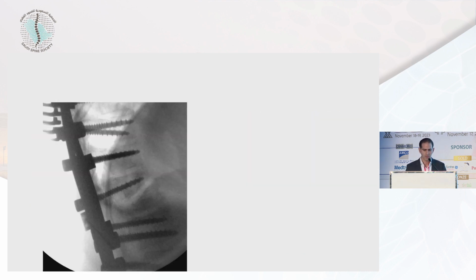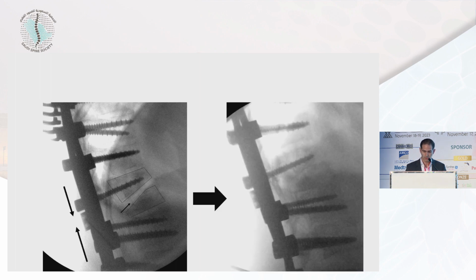And as you can see on these intra-op pictures, the remaining gap between the 2 vertebrae, the one that got osteotomized and the one above, gets completely closed after the use of the domino. And of course, we did not overload or overstress the screws just above and below.